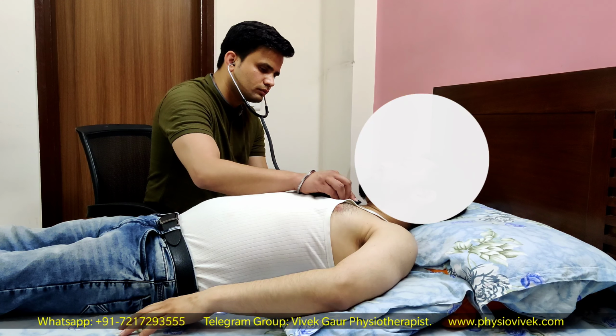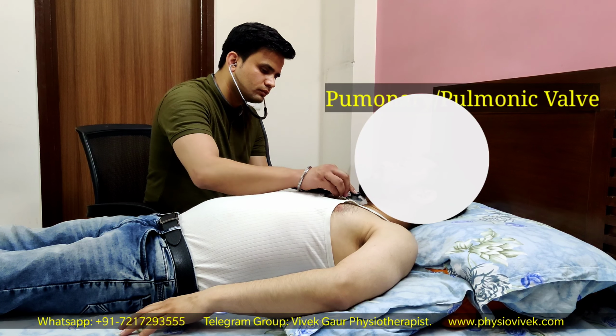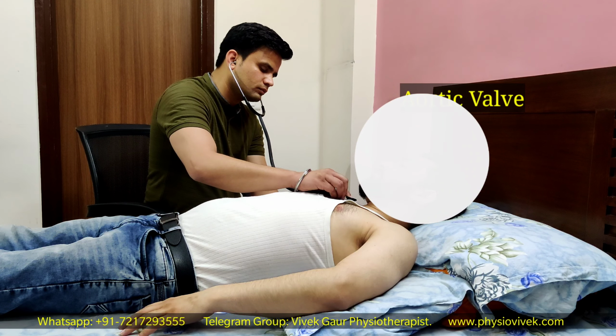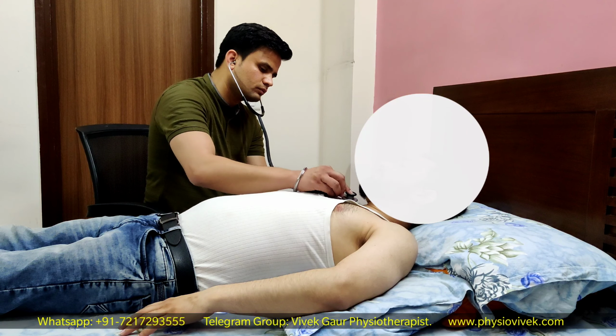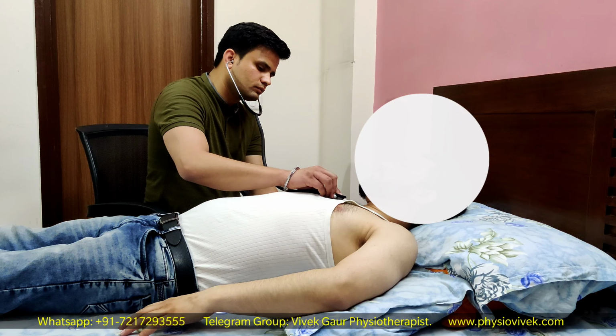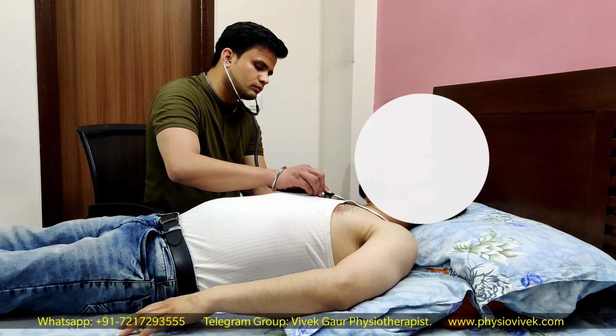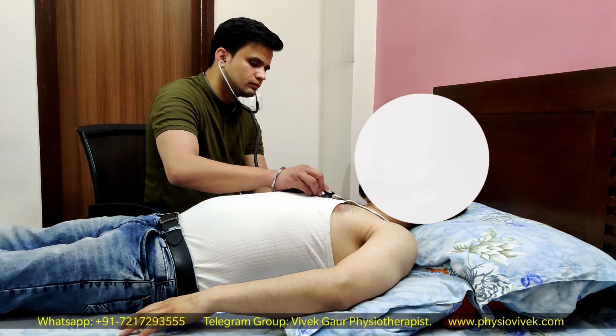Now move your stethoscope to the 2nd intercostal space on the left, where you listen to the pulmonic valve. And right opposite it, in the 2nd intercostal space on the right of the chest, is your aortic valve area. And subsequently move to the right border of the sternum till the 4th or 5th intercostal space. At all these spaces, you have to listen to the intensity, rhythm as well as duration of heart sounds.